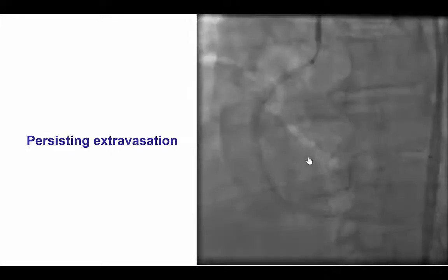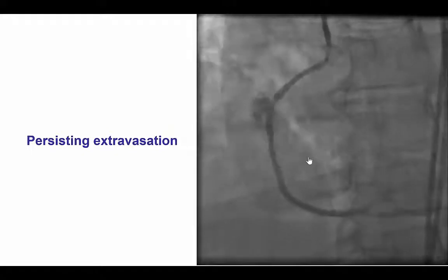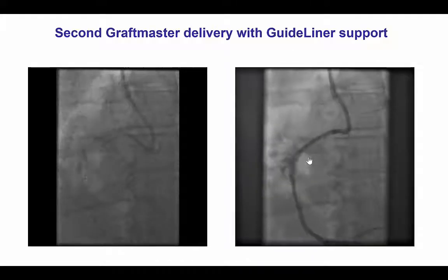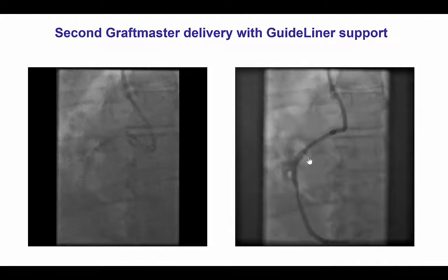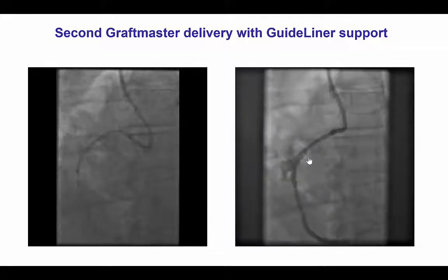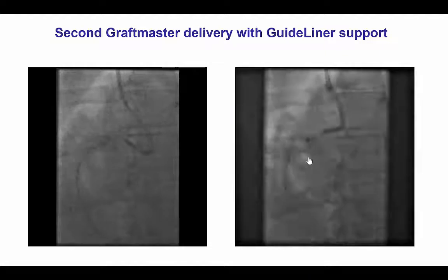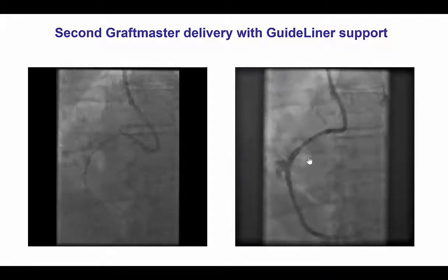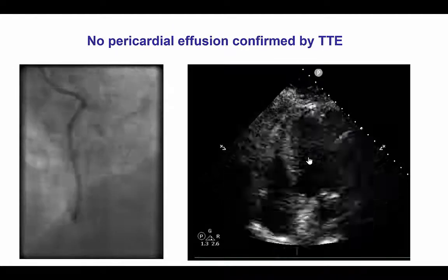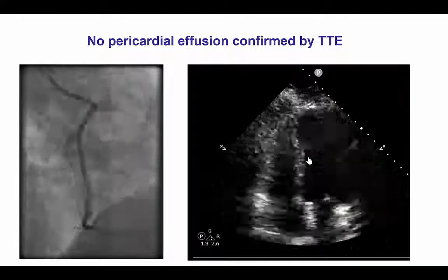Unfortunately, despite placing the covered stent, there continued to be some extravasation in the mid-right coronary artery, and that is why we decided to place a second covered stent, which once again was done using the guideliner. It is interesting that we had an externalized guide wire, but still we did not have the possibility to advance the covered stents, showing how difficult it can be to deliver those bulky devices. Eventually, we were able to deliver the second covered stent, which was deployed.